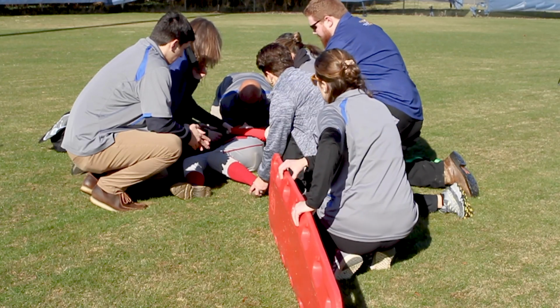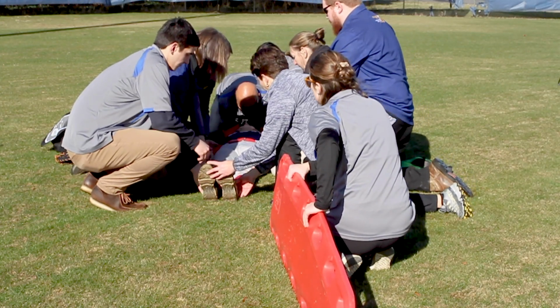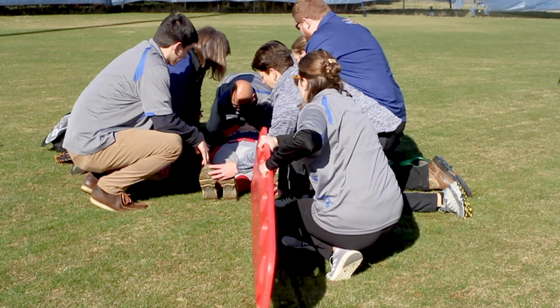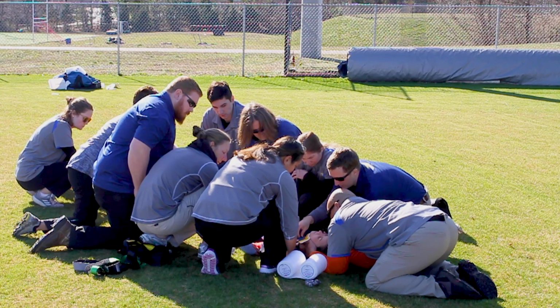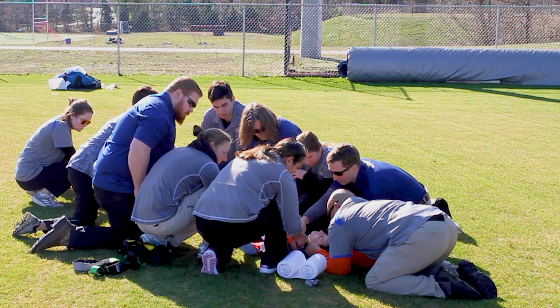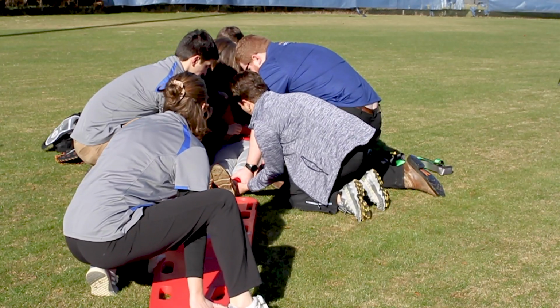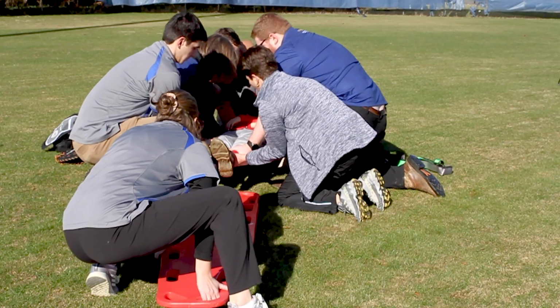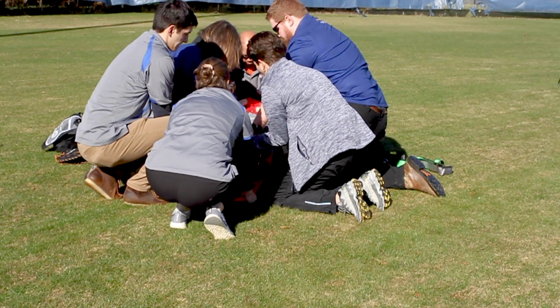The athlete's body is now gently placed in alignment to prepare to place the cervical collar on the athlete. Place the collar on the athlete to achieve spinal restricted motion. Again, this should be measured prior to placement. The board is moved into position, and the lead guides the team to placing the athlete on the board in a coordinated fashion with a cadence and affirmation.